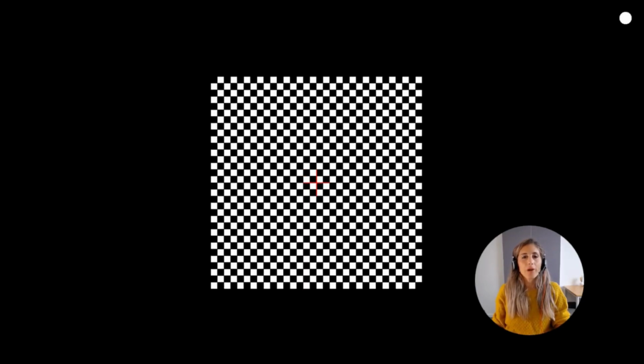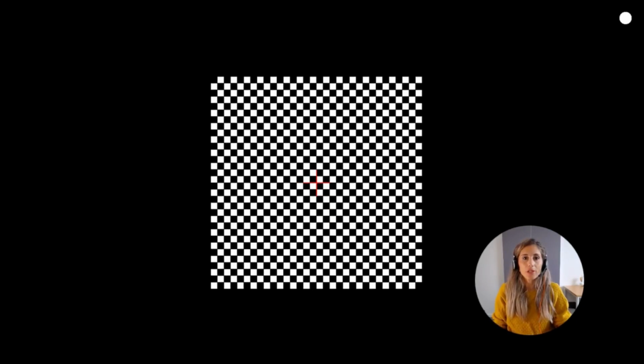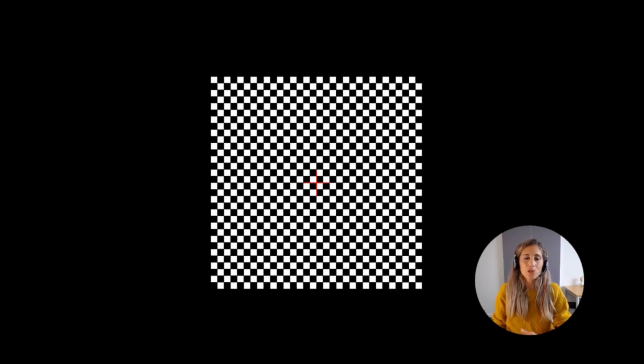When a checkerboard pattern is used, the patients usually look at a screen which is placed around 1 meter away from the participants, looking at a specific point. And the patterns of white and black squares are reversed at regular intervals. And these changes stimulate the visual system. The size of the square is usually around 9 millimeters, but this can be altered according to the test.